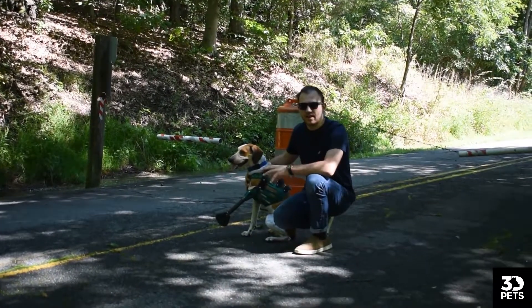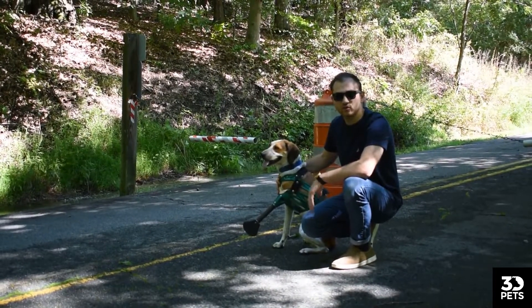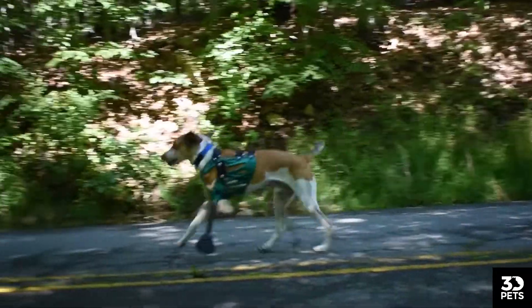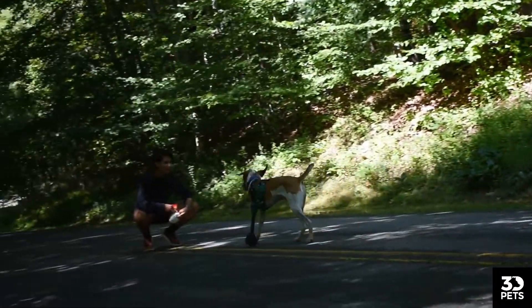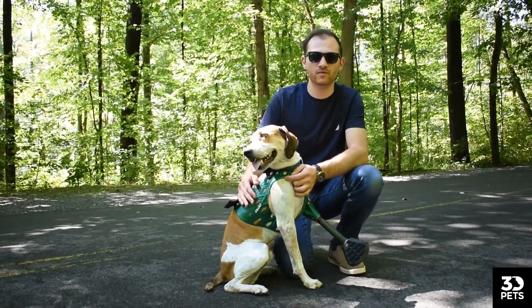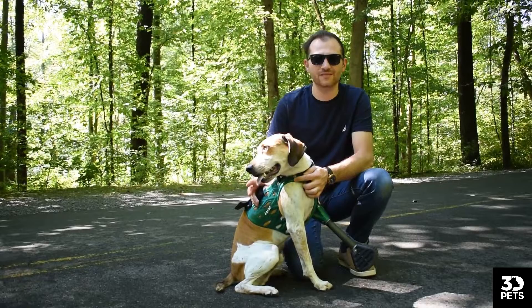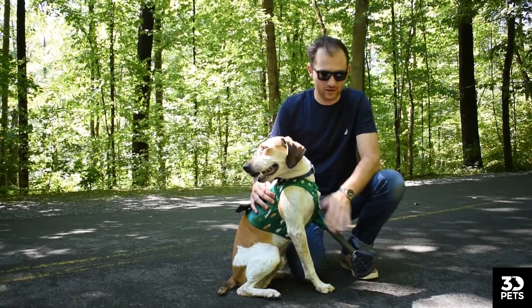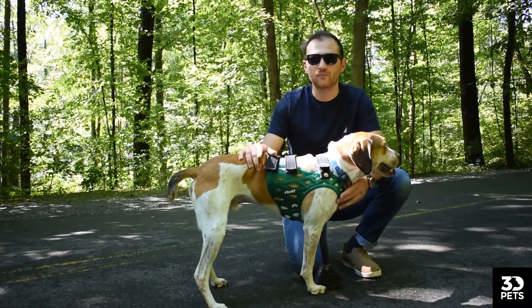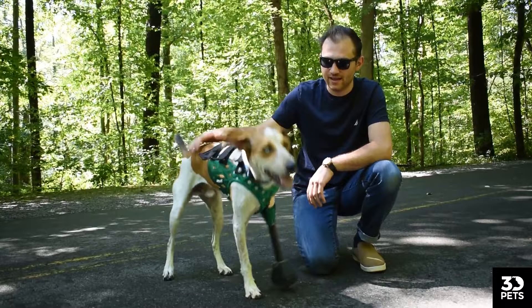With the first few steps, we want to see how they're tapping with the leg and make sure it's actually hitting the ground and not impeding their current motion. If it is, we have to make some adjustments. We're going to let Jack run to his owner and see how he does. As you noticed in that last clip, you could really hear Jack tapping his foot on the ground — that's the type of tapping we want to hear. Dragging is common with the first few weeks, even months sometimes, so don't be discouraged. Jack is a great example — he would not move with this prosthetic on for the first month, but through good training and determination he got to this point. He now uses it every day.